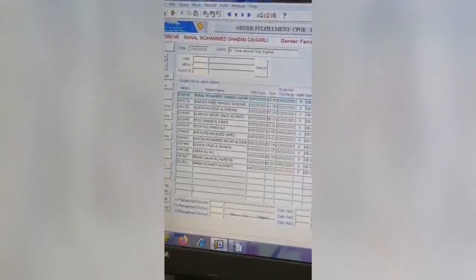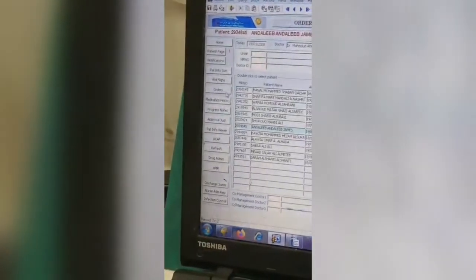Click on the name of the patient to whom you want to do the requisition, and on the left corner of the screen, click Order. On the upper portion, click the tab of Laboratory and make a new request. Enter the clinical history and type packed RBC.